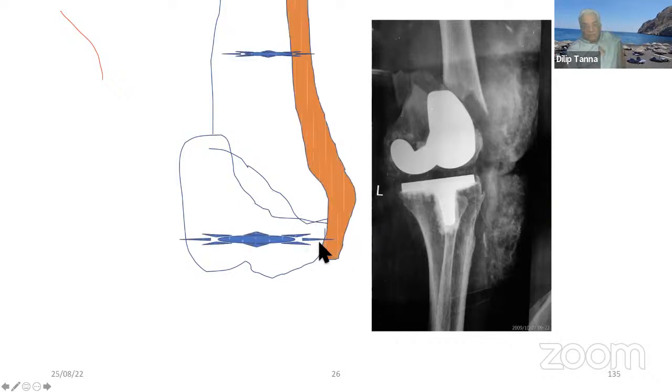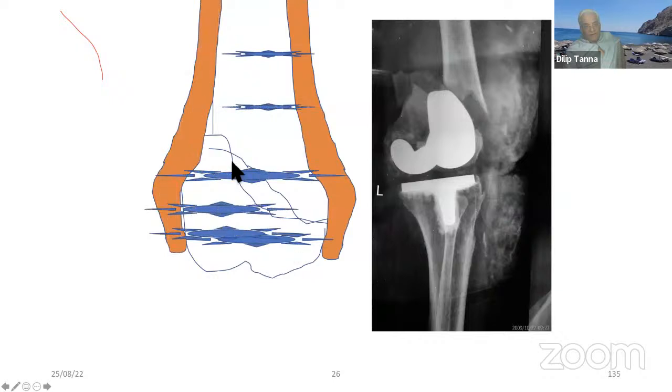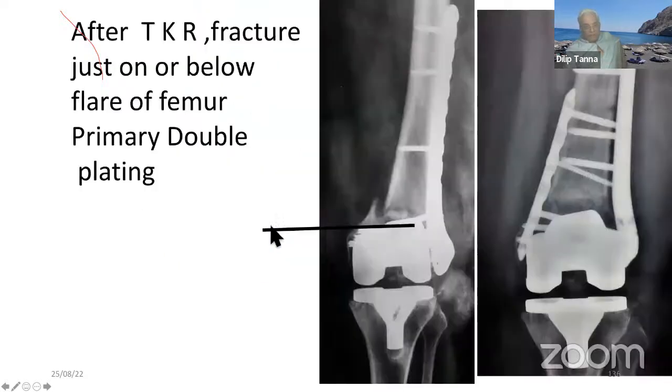So when you put a single plate here, the hold on the distal fragment is only this. So it is desirable that you do a primary double plating in these fractures. So in this one, you convert it to a double plating and this will heal. For a fracture just on or below the flare of the femur, primary double plating is indicated. And I would strongly suggest if any doubt, do a double plating, you will not be a loser.